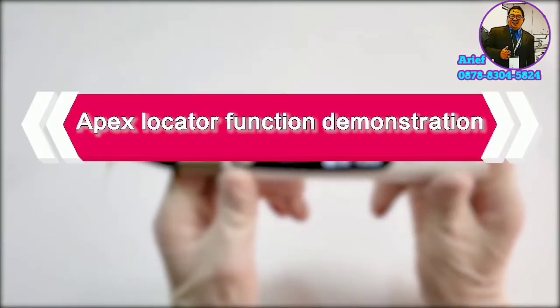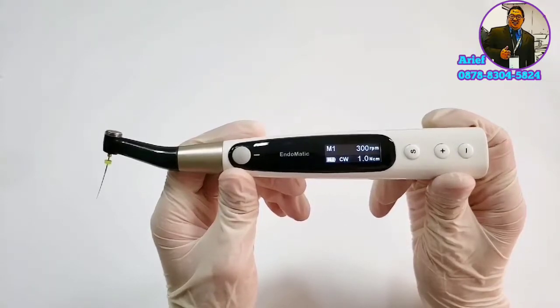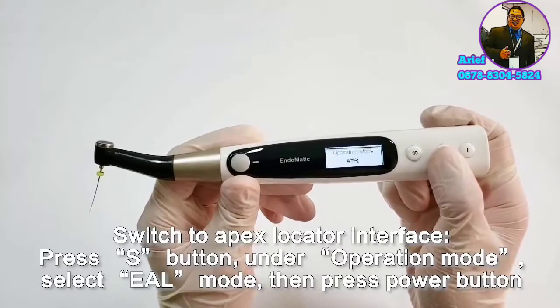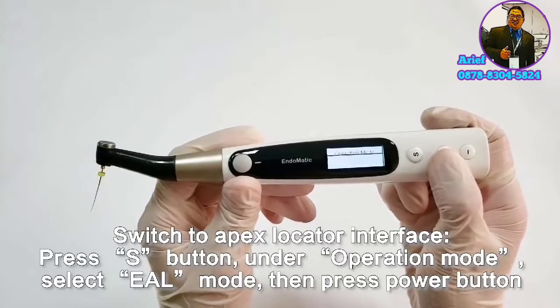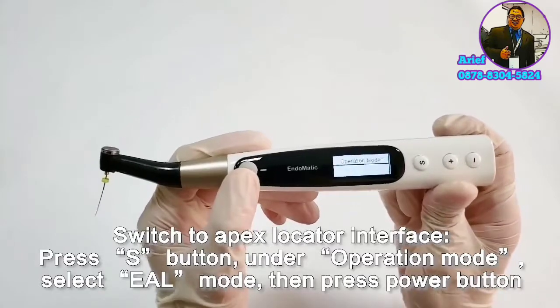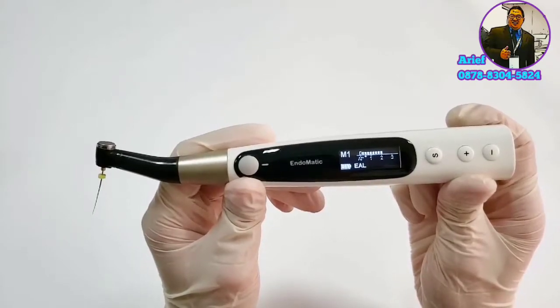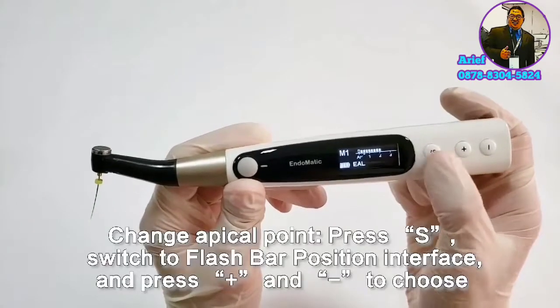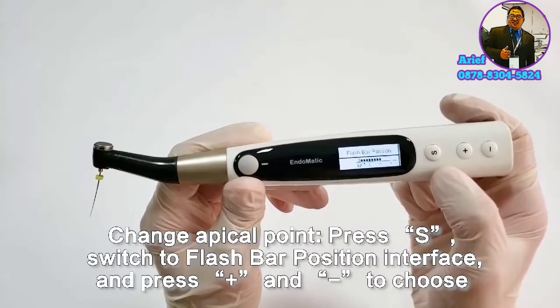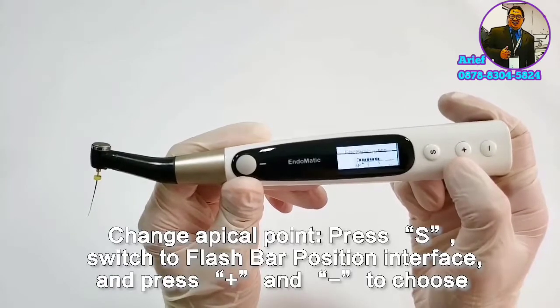Endomatic has an apex locator function. If you want to use only the apex locator function, press the S button, under operation mode select EAL mode, then press the power button and you will see the apex locator interface. If you want to change the apical point, press the S button under the flash bar position interface and press plus or minus to change the apical point according to your demand.